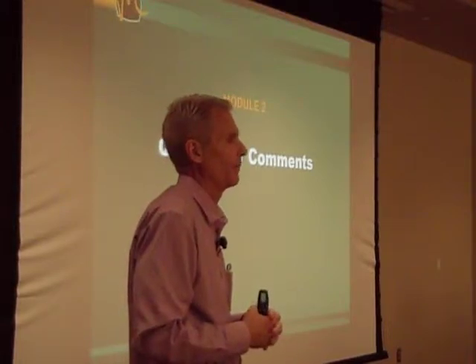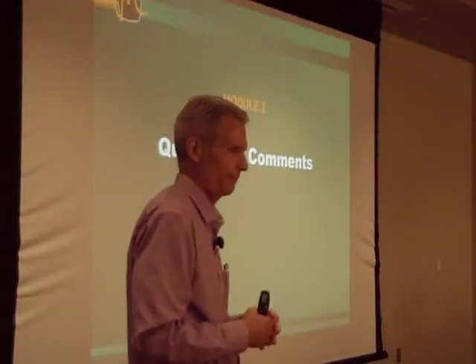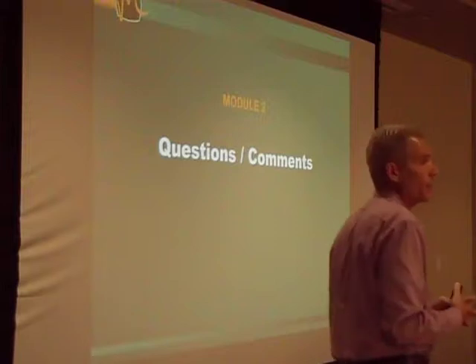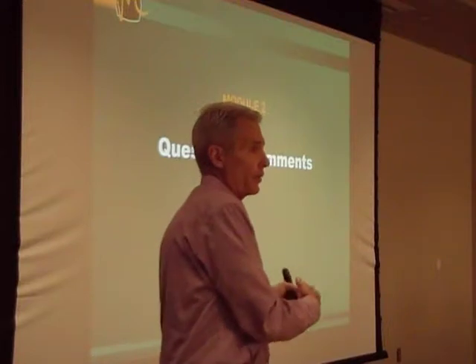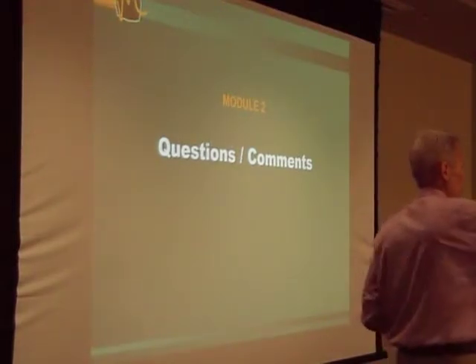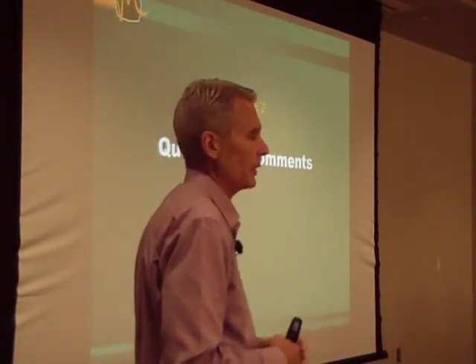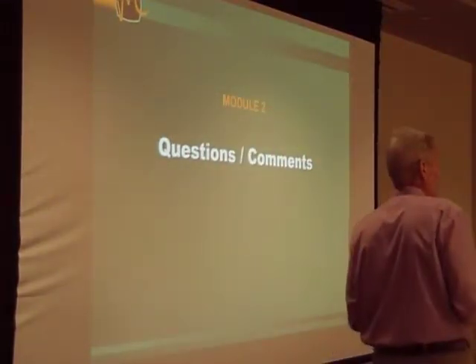For the guys and the girls, do you all feel comfortable acquiring an EKG on a female patient? For the most part? Okay. We always try to maintain their modesty whenever possible. I know it's difficult. If you have a female partner or a female in your crew, sometimes it might be easier. But certainly with gloved hands, you want to use the back of your hand as opposed to grabbing with your fingers. These are just common sense things. And I realize it's more difficult. It is. But we have to do our part because we're there to make sure that we're doing the ultimate best for our patient.